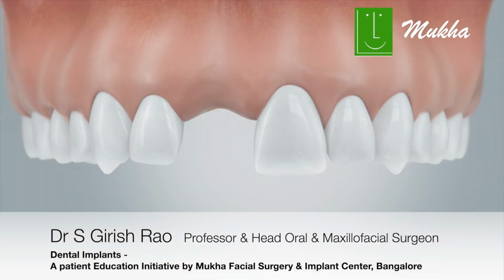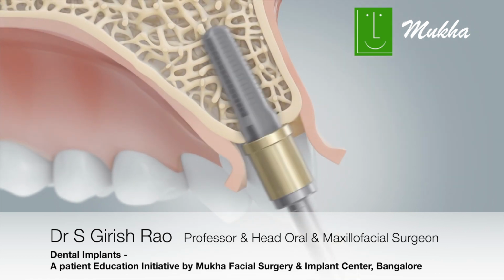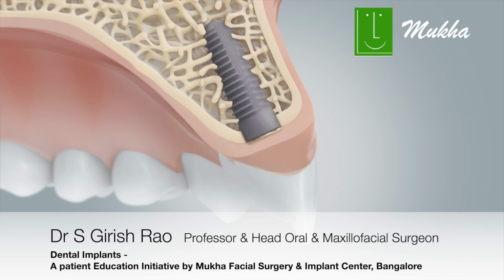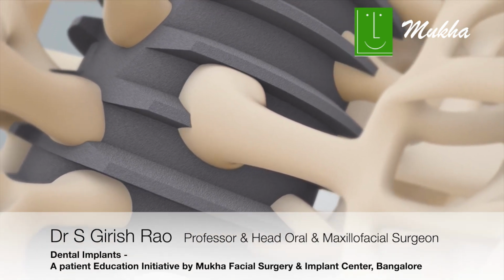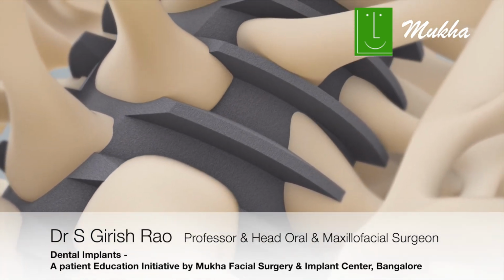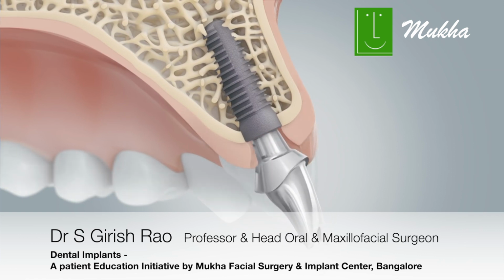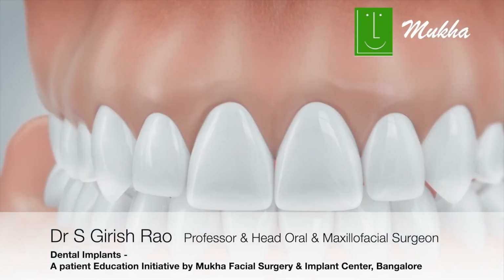Now with dental implants, we can basically fix this screw made of titanium directly into the area where you have lost the tooth. And once this dental implant gets integrated into the bone, that means that it becomes a part of your bone itself. To this we can fix another structure which is called an abutment, which juts out of the gum, to which you can directly fix a crown.